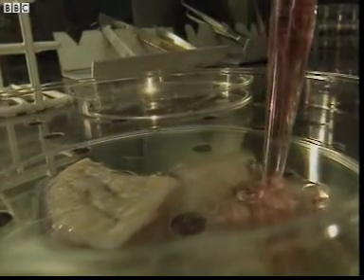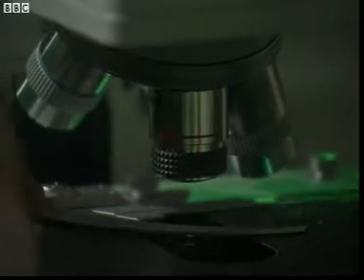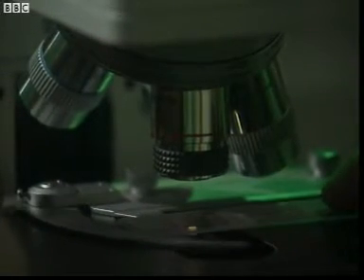If this is investigation, I'm going to have to seek out someone who really knows. So I've come to see Robin Martin at the Blond McIndoe Centre in East Grinstead. Here, they actually grow skin in the laboratory to help treat burns patients like Teresa here. And because the skin they're growing comes from the patient, they know it won't be rejected by the body. But first, they've got to choose the right cells, because not all cells in the body are the same.